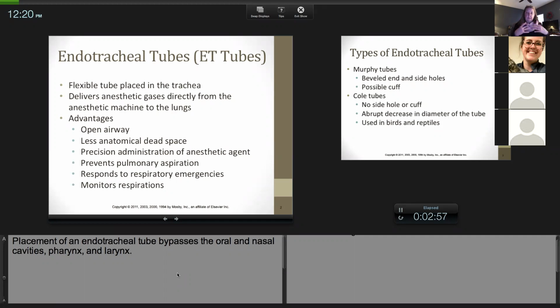And it also protects the airway because when you inflate the cuff, first of all, that prevents leakage around the endotracheal tube. And remember, it can also prevent aspiration. So you're protecting the airway. I don't know if it's happened to any of your patients, but sometimes during the procedure you'll get passive regurgitation. You'll notice some stuff comes out of their nose, or sometimes it pools in their mouth. They'll get some stomach contents. So even if they're not actively vomiting, you do have regurgitation that you have to be cautious of. So these are all the benefits.